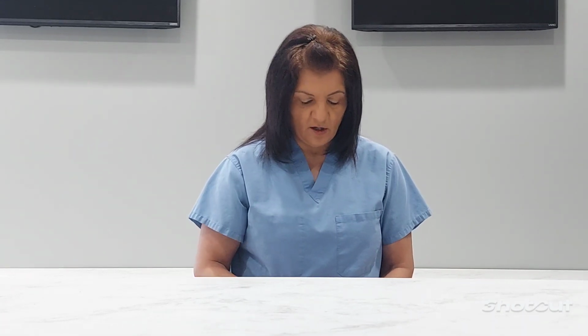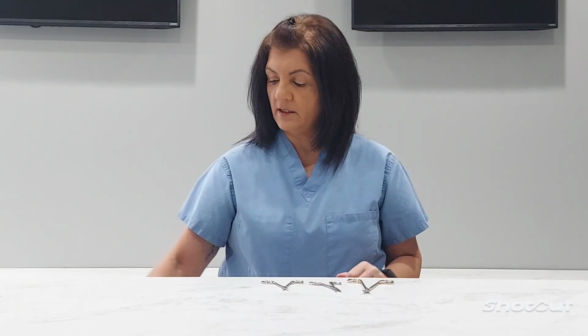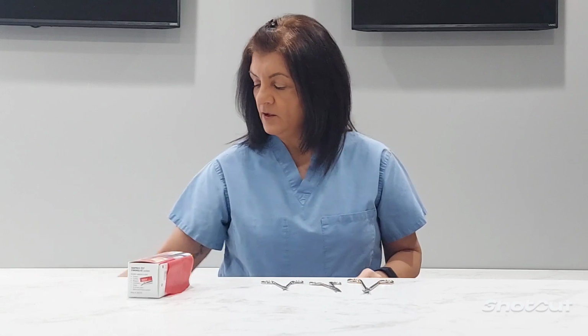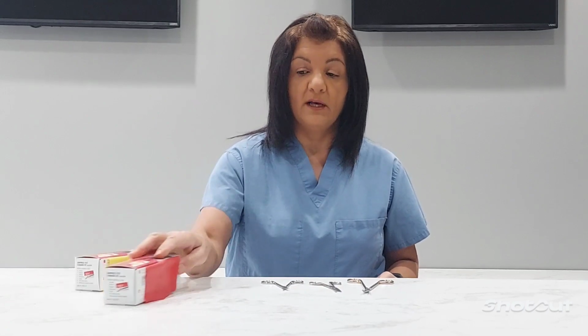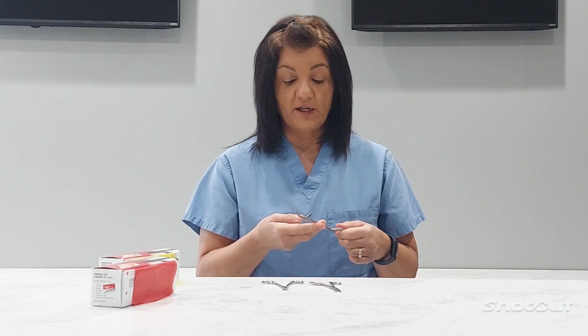Our next items are scissors. So again, I want to touch on scissor testing. There's really not a whole lot of different ways to test your scissors. The first thing you're going to do, again, is your general inspection. You're looking for pits, cracks, rust, and stains.